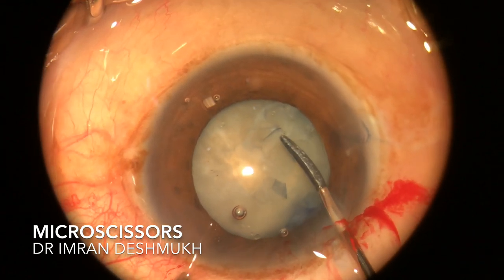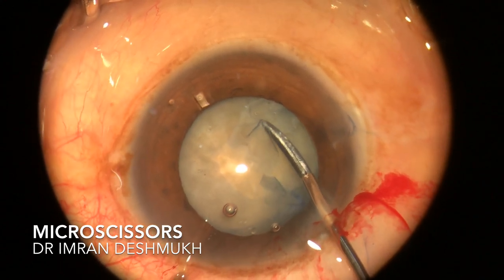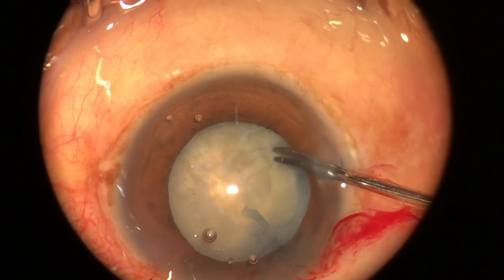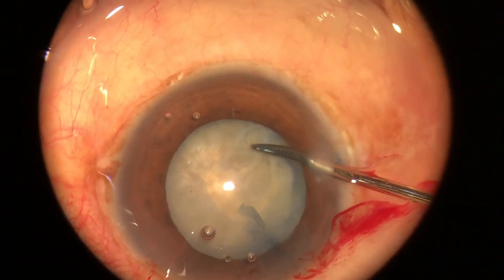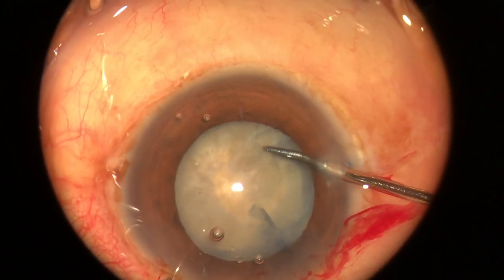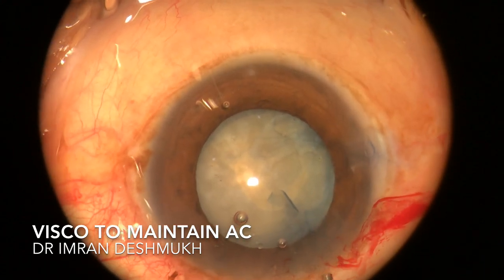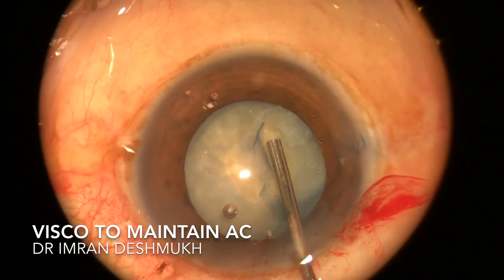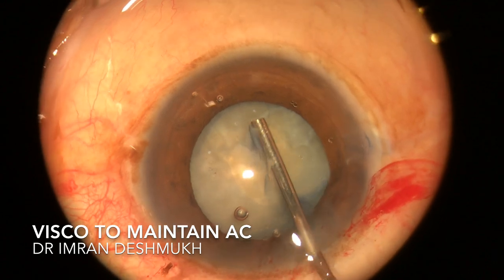I used the micro scissors in such a way that it is naturally being converted into a rhexis. Then I entered the side port and started extending the rhexis. You have to be very careful because at times the rhexis can extend to the periphery and can also cause a posterior capsule rent.